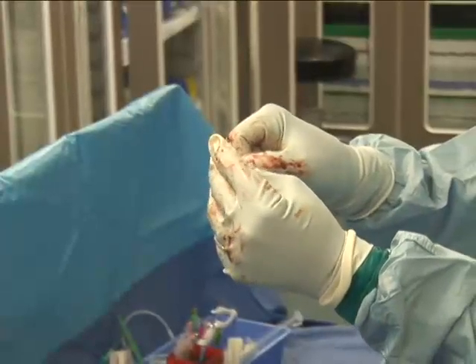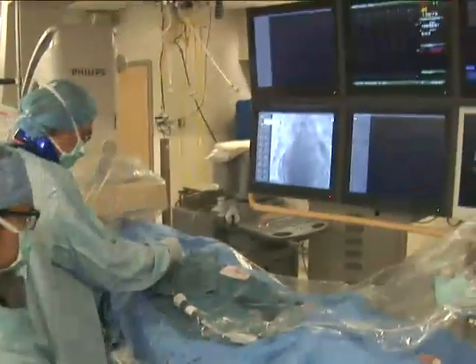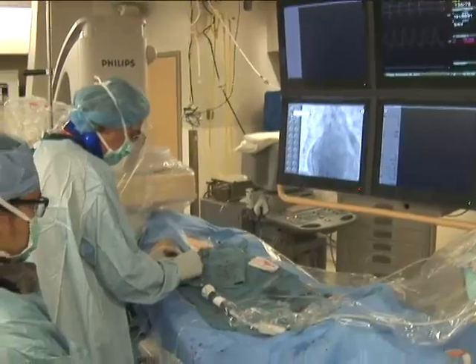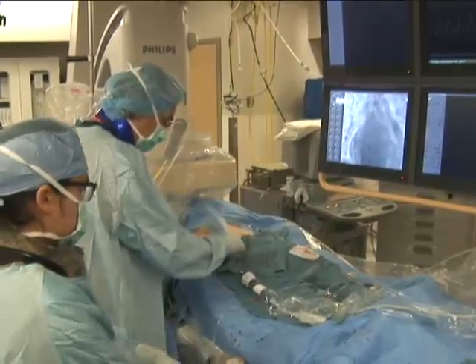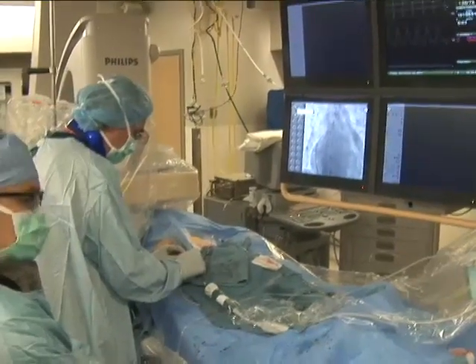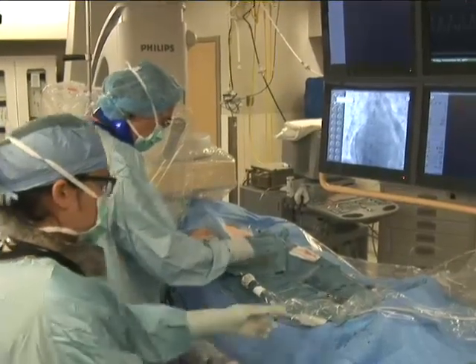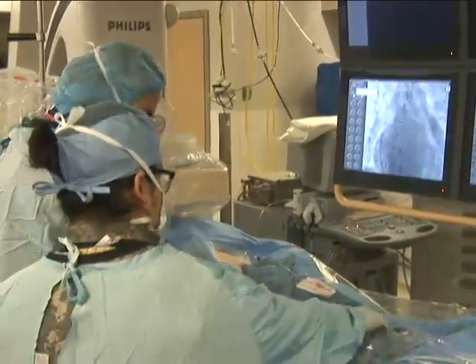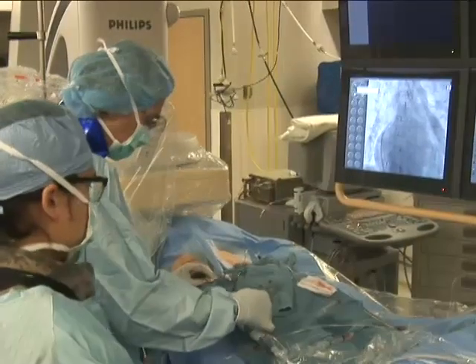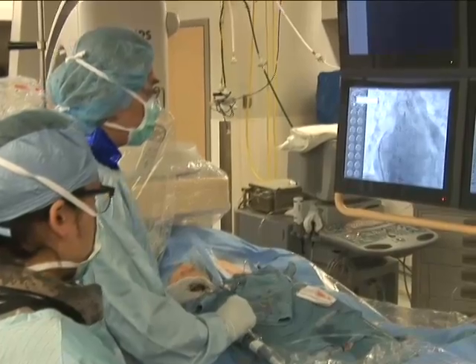The Brockenbrough needle has a gentle curve on its tip. Many operators will accentuate this curve a little bit for relatively normal anatomy, with greater degrees of curvature applied if a significantly dilated right atrium is present. The stopcock is removed from the transseptal dilator, and the Brockenbrough needle is inserted. This may be done with or without the included stylet, which may ensure the needle does not catch on the dilator as it is being passed through the dilator.